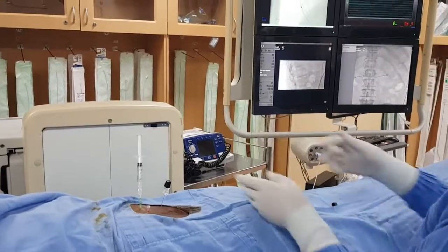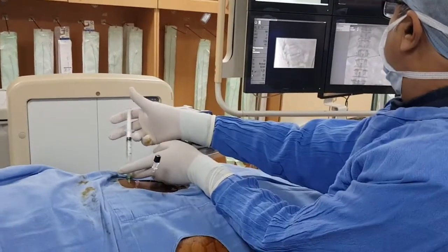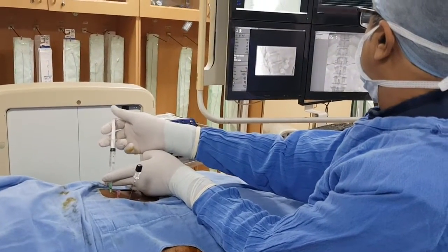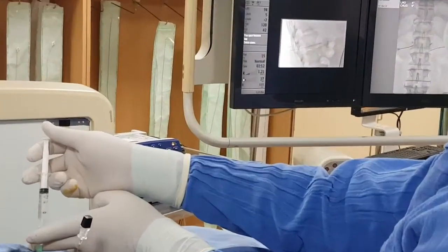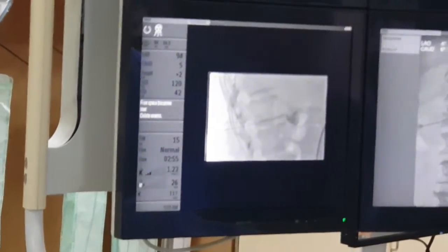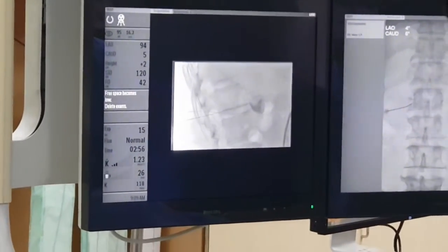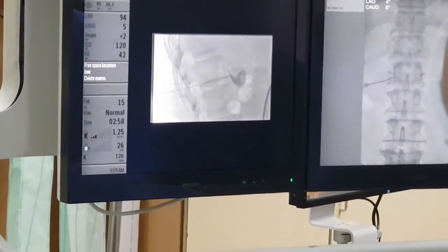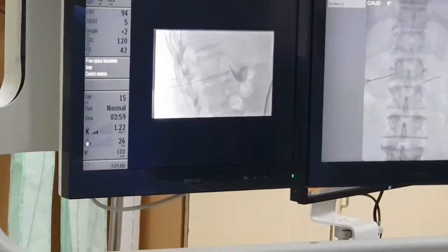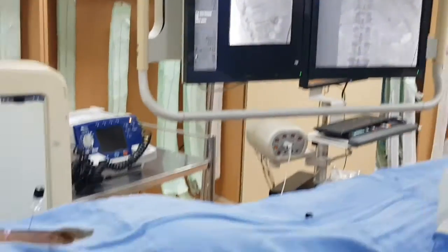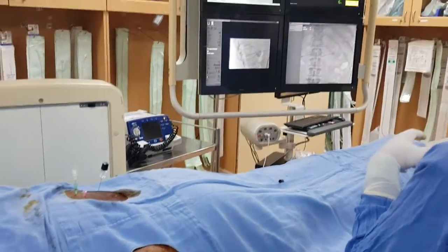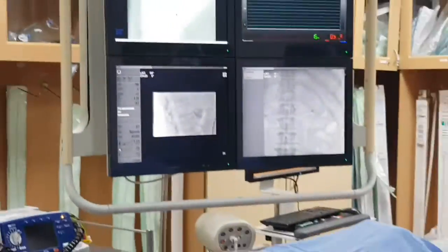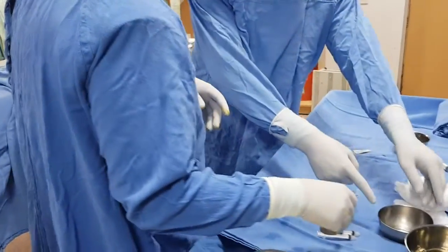Now we will start. That is the diaphragmatic crus. We will continue with the lateral view. That is the contrast — this is contrast being instilled.